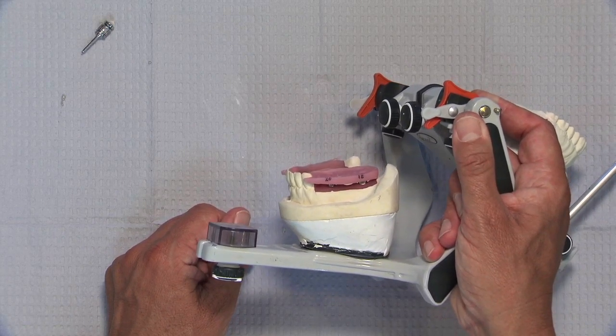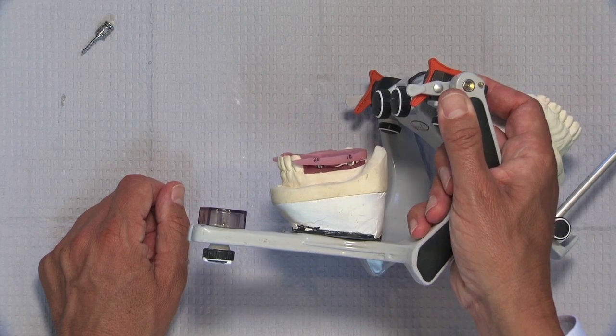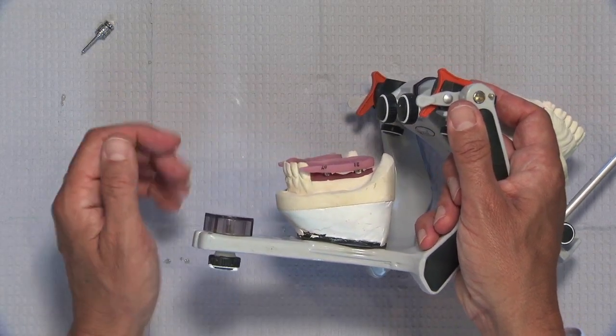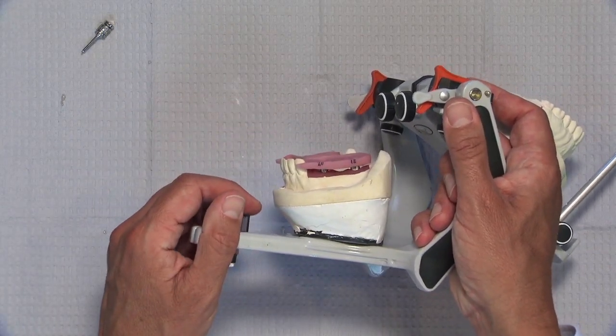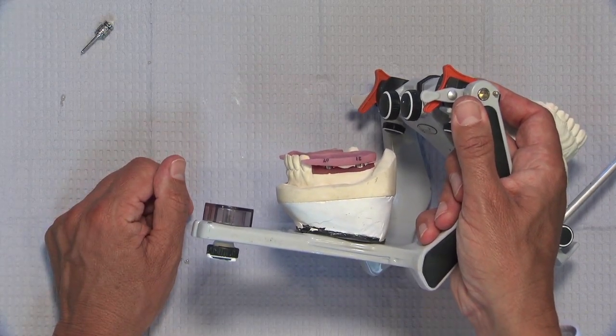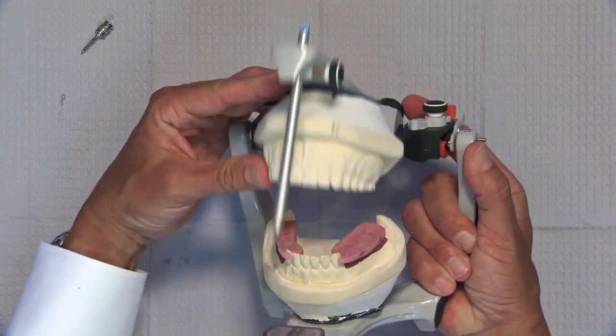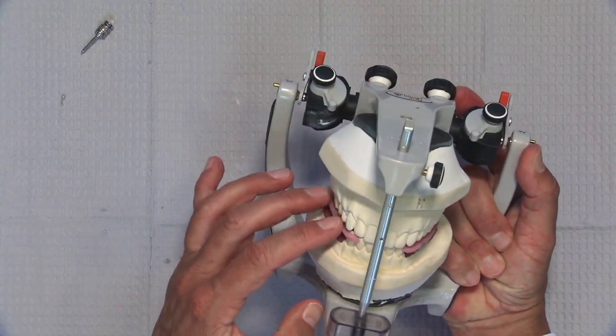And if you do, that's fine. And you're going to save yourself a lot of time at the seat appointment in adjustments if you do this type of bite registration. I just find it to be easier to do it in conjunction with the custom abutments and be able to get this bite. So let's go ahead now that we've got this free and the patient can close down all the way without any interference and we've got our stable platform.